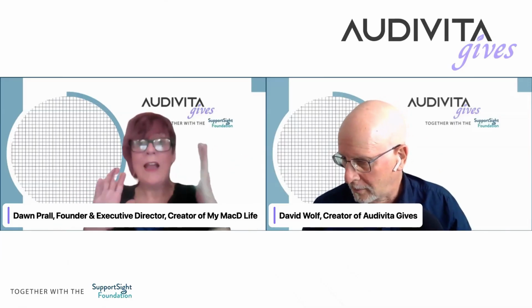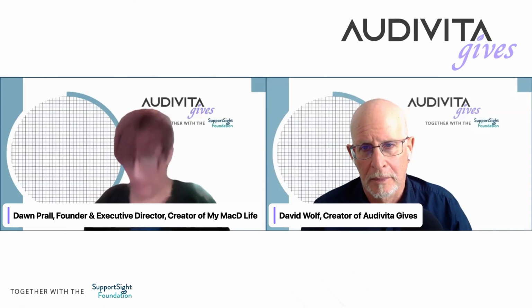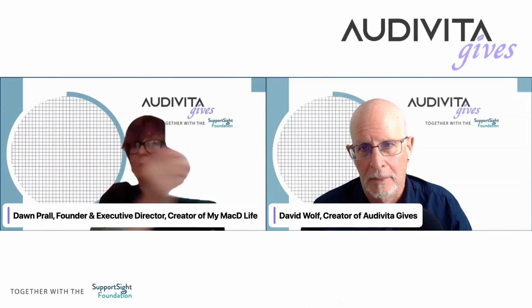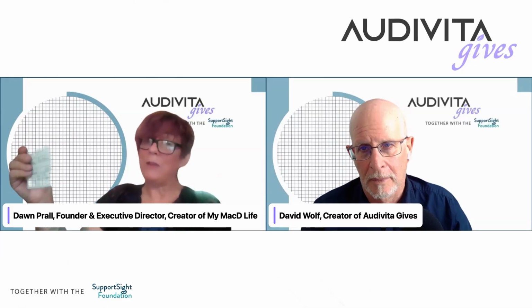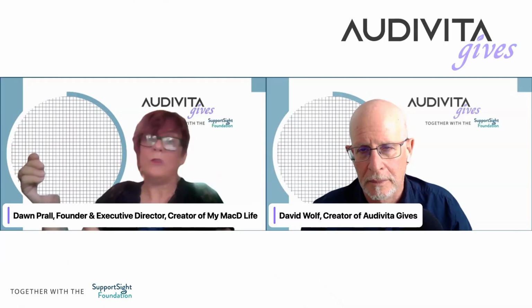Now, you're looking at the Amsler grid. The Amsler grid is in front of you. You might be looking down at it with lots of light. Often I don't recommend that. I'm holding mine up and it's matching that grid there. I don't recommend that people hold it in front of them by hand, because if you have a tremor or you're shaky, or our hands are in motion, our bodies are in motion all the time, it's going to create vibration, whether you think you're steady or not.